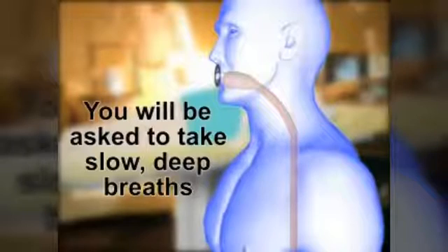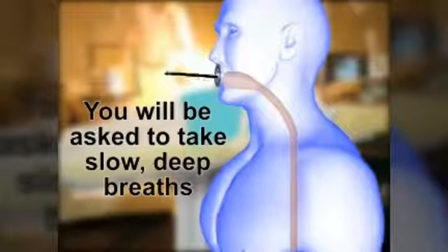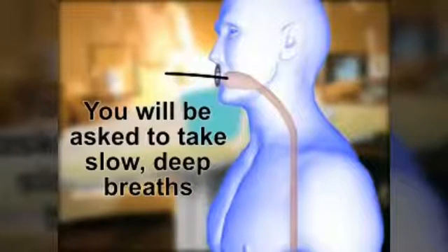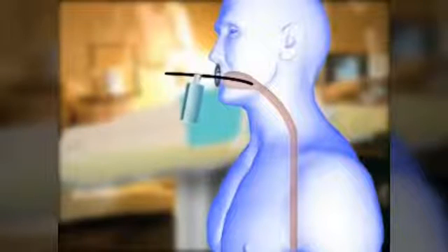You will then be instructed to put your chin to your chest and open your mouth. As the doctor begins to push the tube in, you will be asked to swallow. Swallowing makes the tube go down more easily. If you gag when the tube enters your food pipe, the nurse will spray more numbing medicine on your throat to decrease your gag reflex and make you more comfortable.